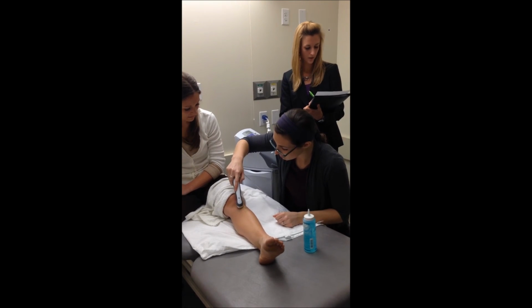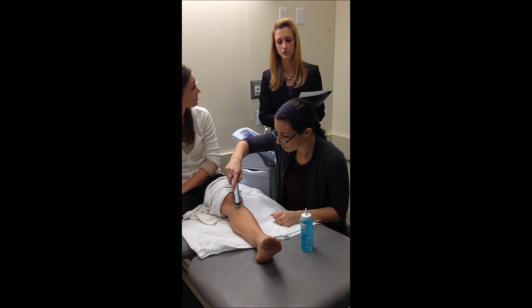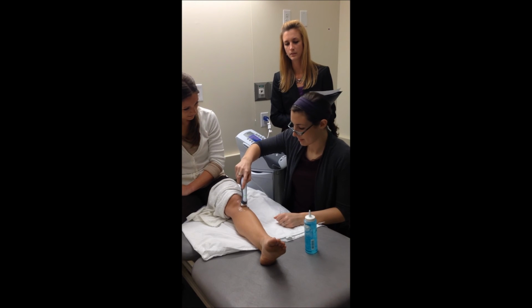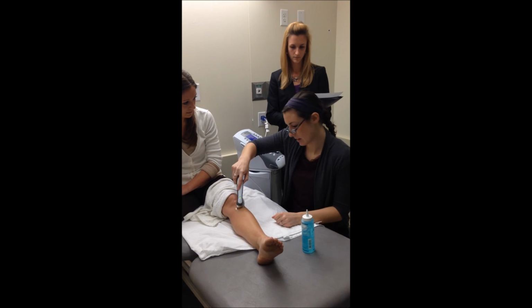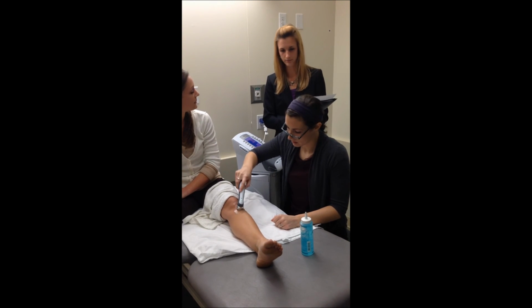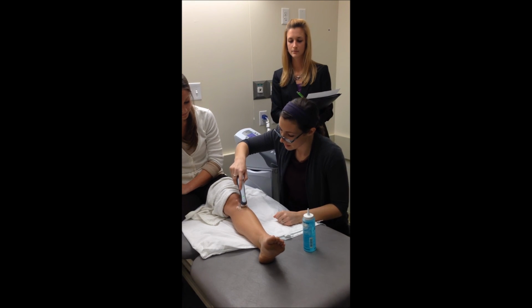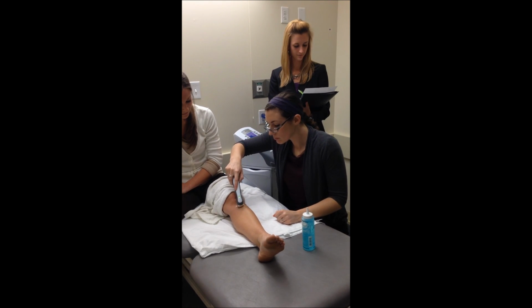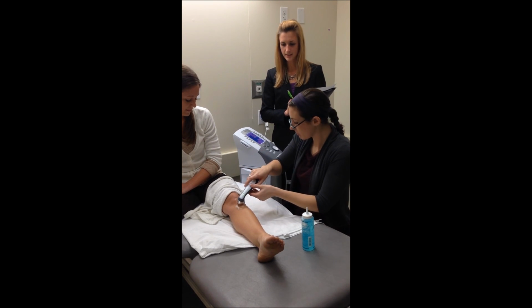Okay, Rhonda, can you tell me a scenario where you would stop ultrasound? Well, I mean, if she was going to kick me in the face, she was probably in a lot of pain, I'd probably stop. Okay. And what is a reason why you would do it on the patellar tendon? Well, you're a runner, aren't you? I think she's having a lot of pain, that patellofemoral pain. Very good. Do I have to keep going? Yep, you can go ahead and stop.